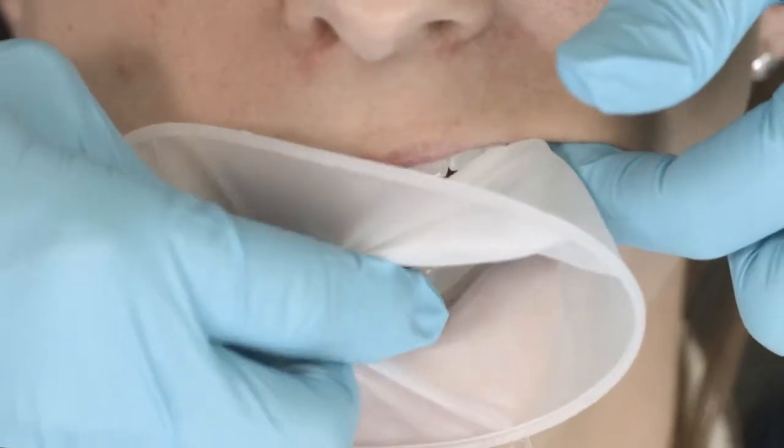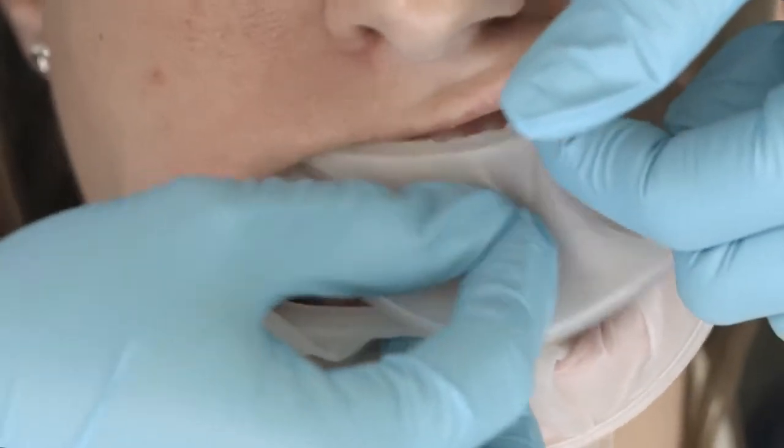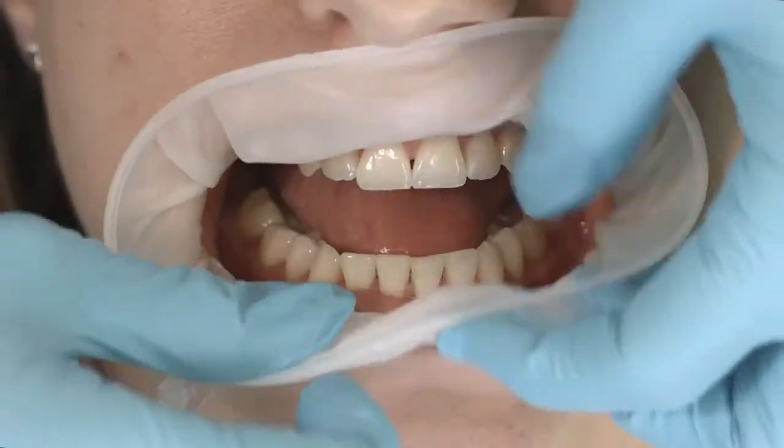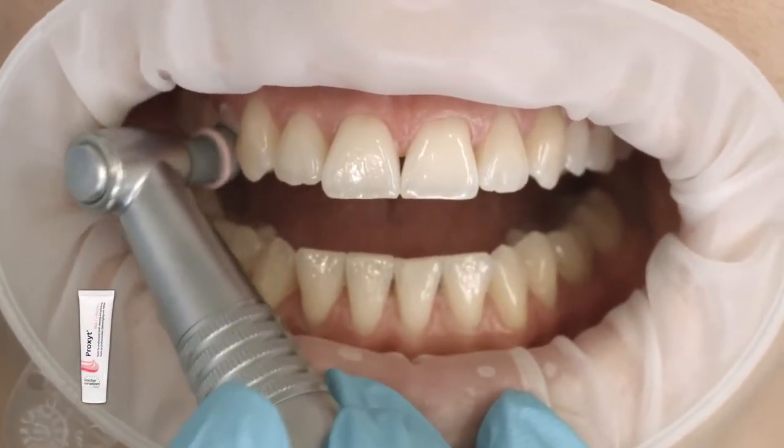Our tip: use a flexible lip and cheek retractor such as Optrogate. Optrogate gives you easier access to the oral cavity. Under field conditions, thorough tooth brushing will be sufficient.